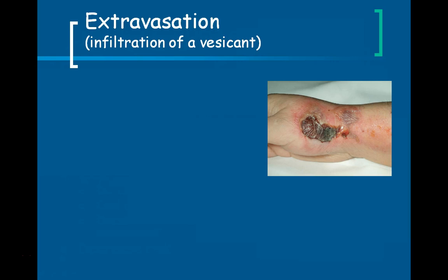The types of fluids that cause extravasation are, for instance, anti-neoplastics or chemotherapy. IV contrast is very caustic. Potassium, so if your patient has a solution with potassium in it, or high electrolyte solutions.